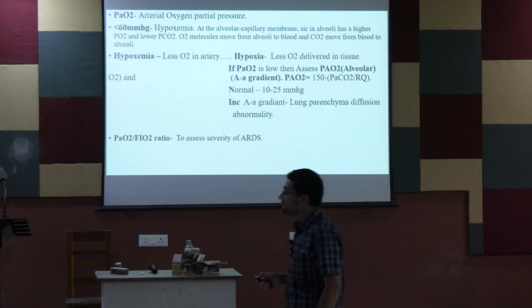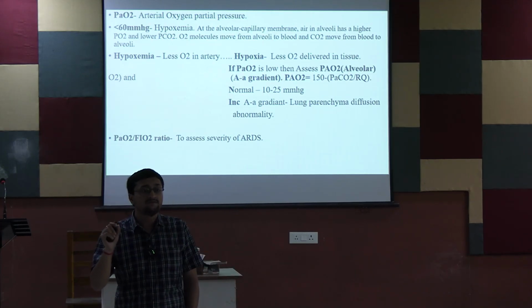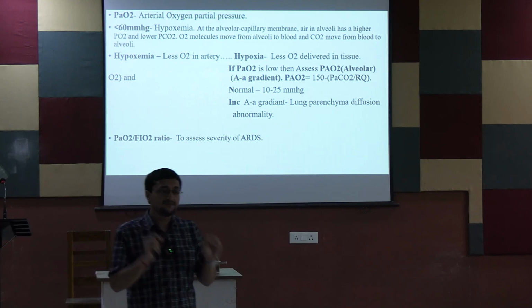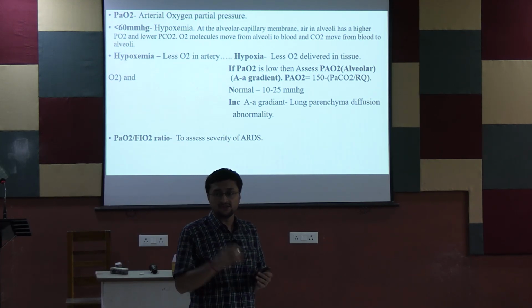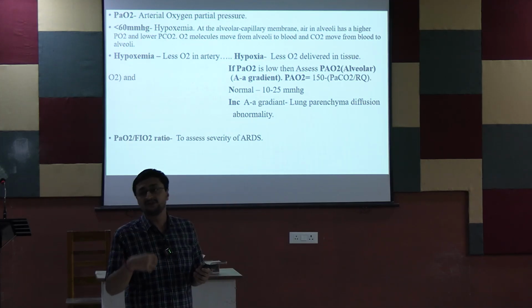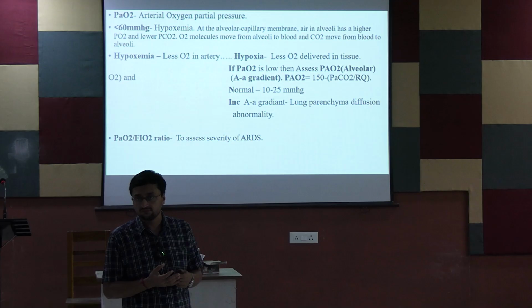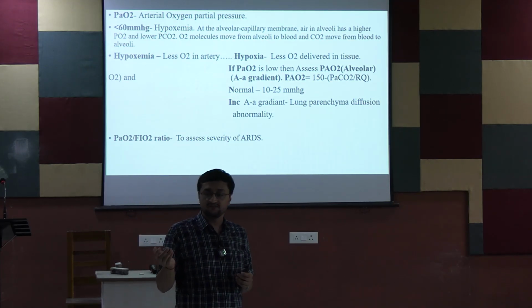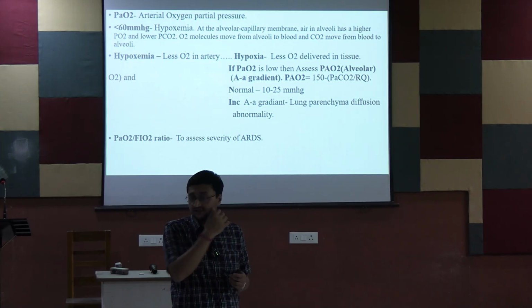And next, very important one, to assess the PF ratio. This is also important. PF ratio, that means PaO2 FiO2 ratio. Suppose you are giving oxygen. What is FiO2? How to calculate FiO2? জানিস না? FiO2 কি করে ক্যালকুলেট করে? Any idea? There is a chart of calculating FiO2.